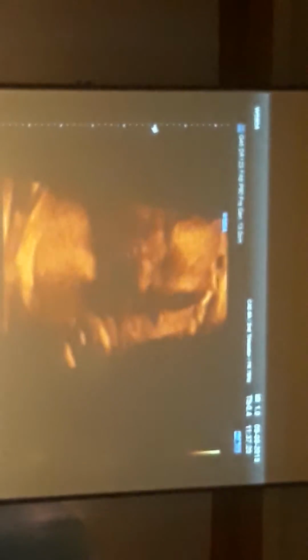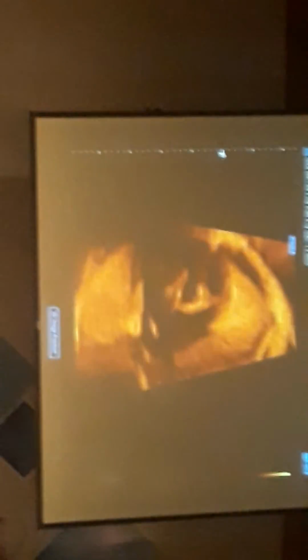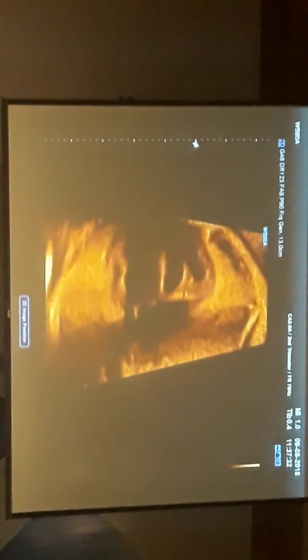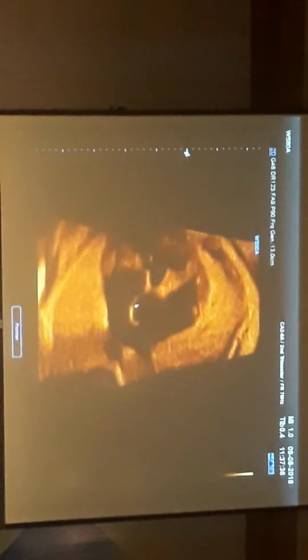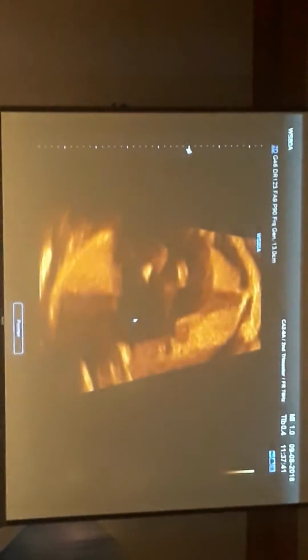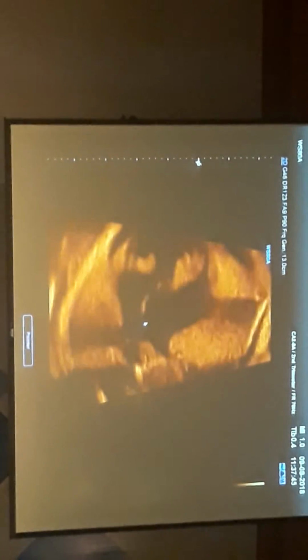So I was not able to see both pulmonary arteries with this view. I only saw the bifurcation. So I needed to go transverse. And here's the atrial septum. Some of these babies develop a restrictive foramen ovale and need to have that opened up after birth.